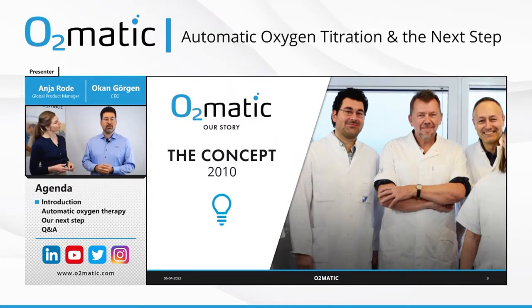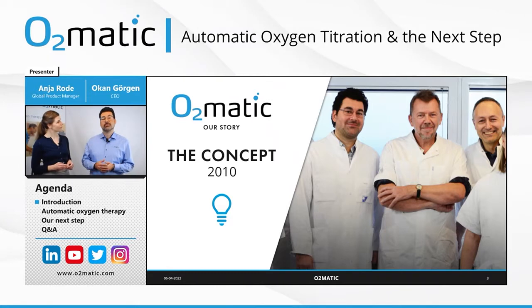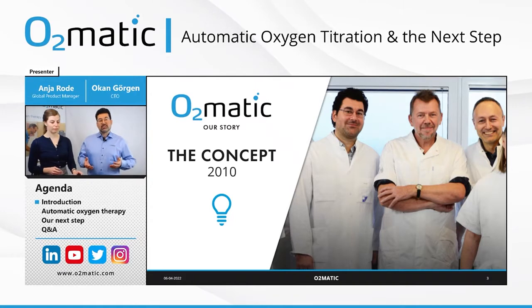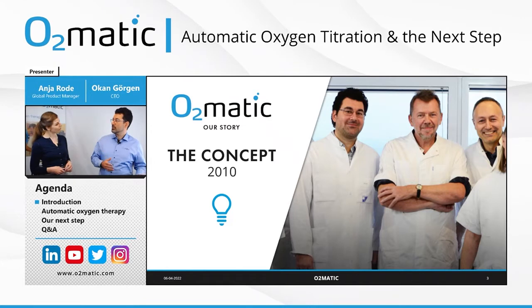It was together with chief physicians, both in cardiology and pulmonary, and we had this idea that we could optimize the way we are treating COPD patients today, because we knew at that time that they required a lot of resources to keep them within a target range of oxygen. This was because they were oxygen sensitive, which means that if they got too much oxygen, it was dangerous for them. And if they got too little oxygen, it was dangerous for them. So this seemed very simple for us. Let's use modern technology to make a solution that could help these patients. So we started working on that.